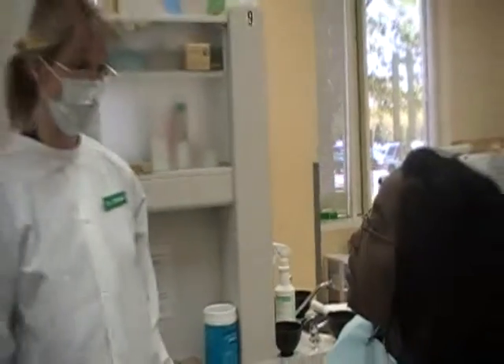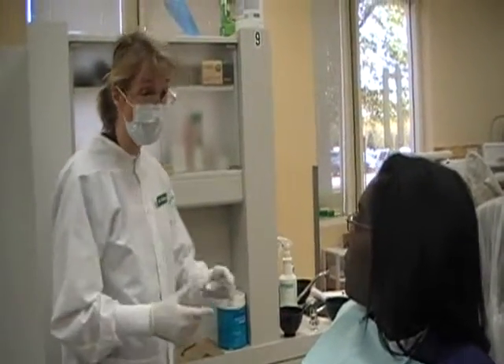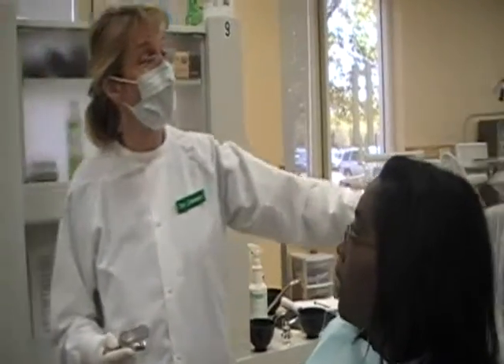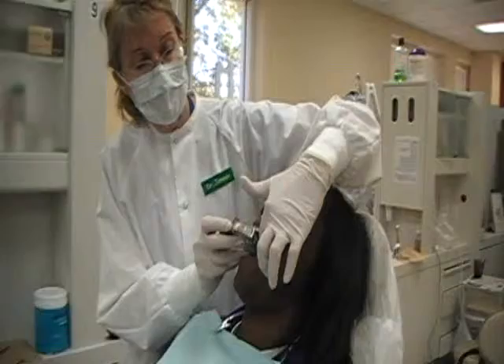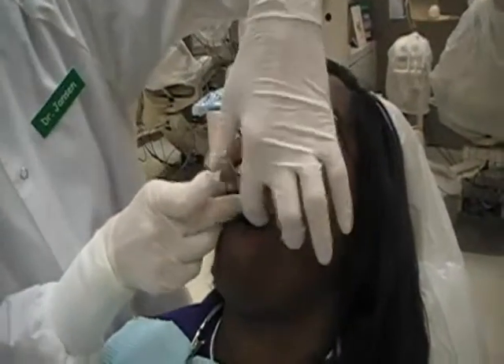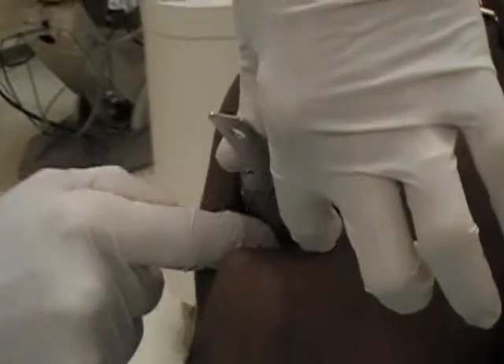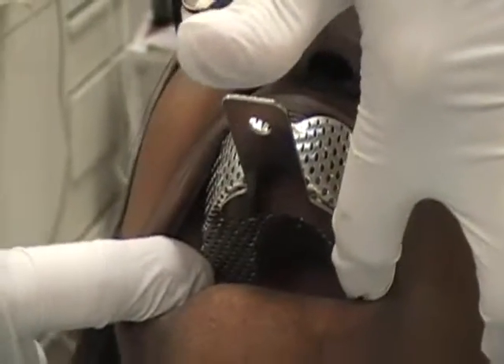I'm going to be taking some impressions today. What I need to do first is to check and make sure these trays are the correct size. If you'll rest your head on the headrest, what I'm going to be doing is placing this. What I'm looking for on the maxillary is to see if the maxillary tuberosity areas are covered, and they are.